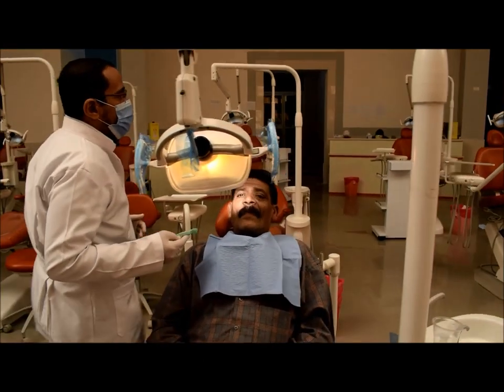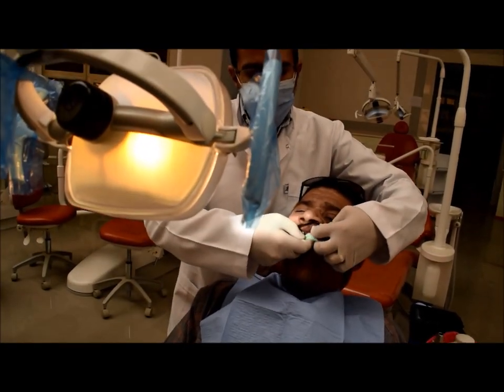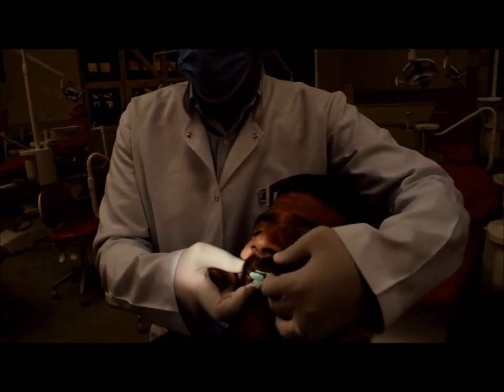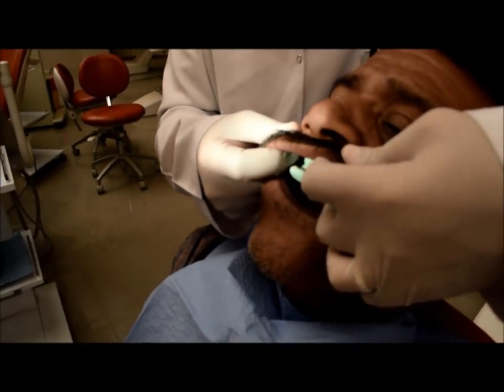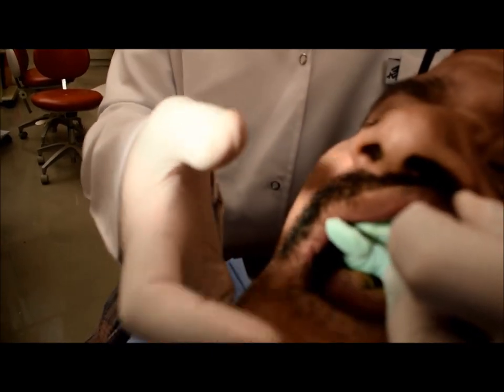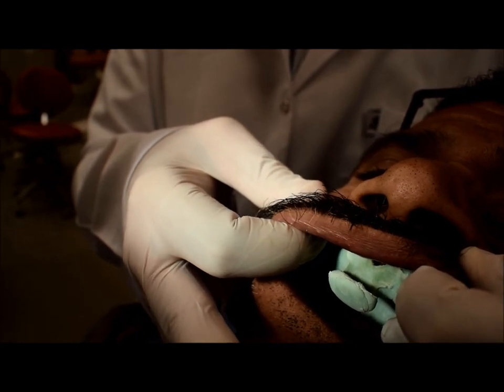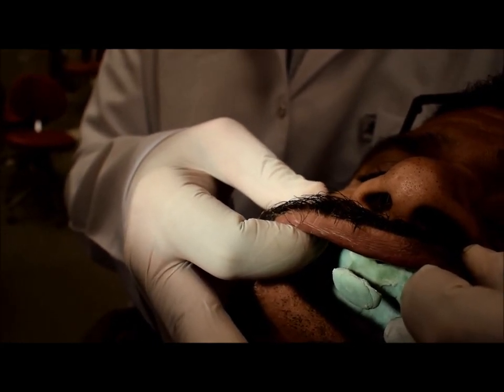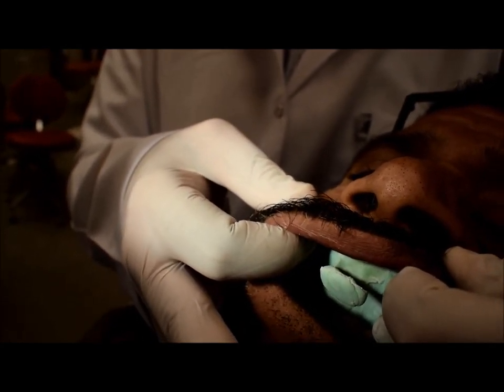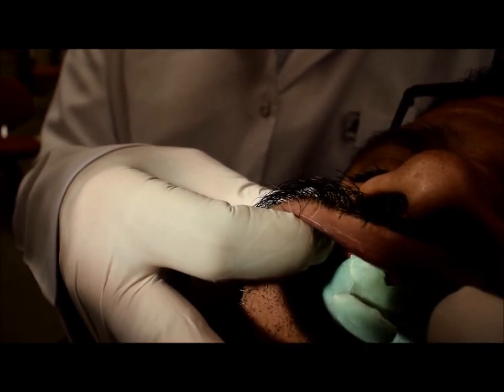For the upper impression, I have to stand behind the patient. I rotate the tray, then I insert the tray. For the labial border, I have to retract the lip 45 degrees and the patient closes a little bit so that the vestibule and the lips are not stretched. The border of the tray should be shorter than the full depth of the vestibule, about 2-3 mm, not more than that.